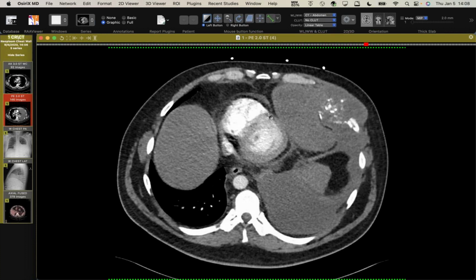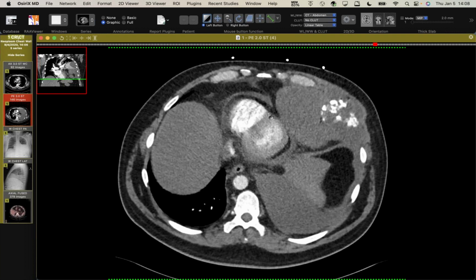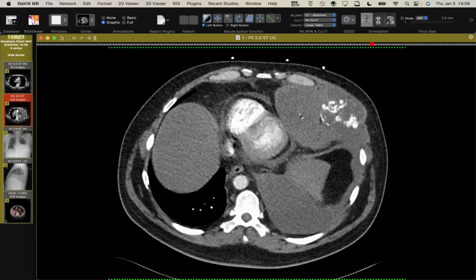So just a really big sarcoma, but I've seen this phenomenon a couple times where you get dedifferentiation and you have matrix in one portion and the other portion is pure soft tissue. And we've seen these with some liposarcomas, and these can be more aggressive than the better behaved components of the sarcomas.